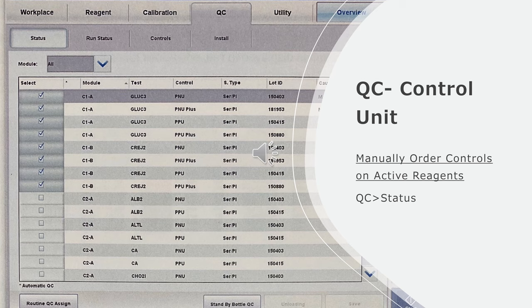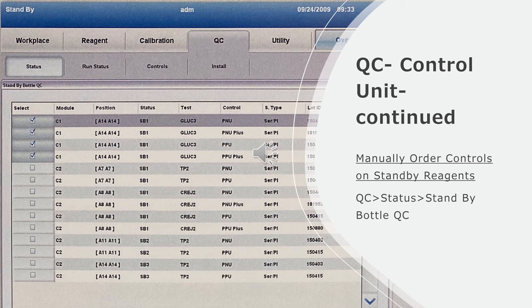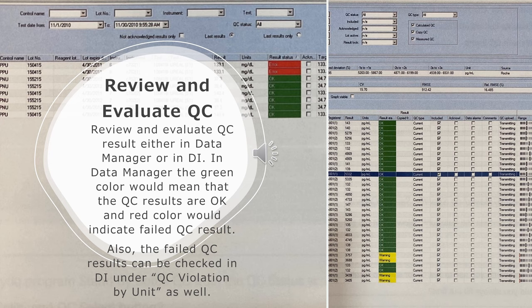Manually order controls on active reagents: Go to QC and then choose status. Manually order controls on standby reagents: Go to QC, then choose status, and then choose standby batch QC.